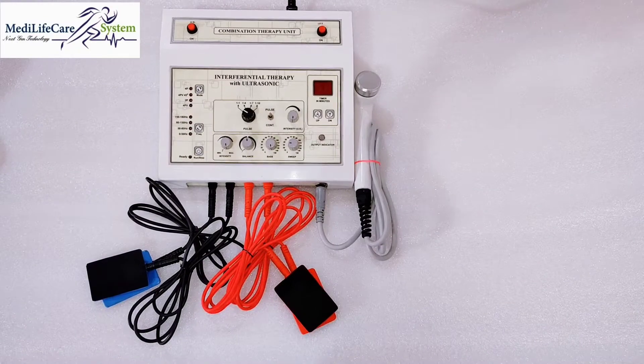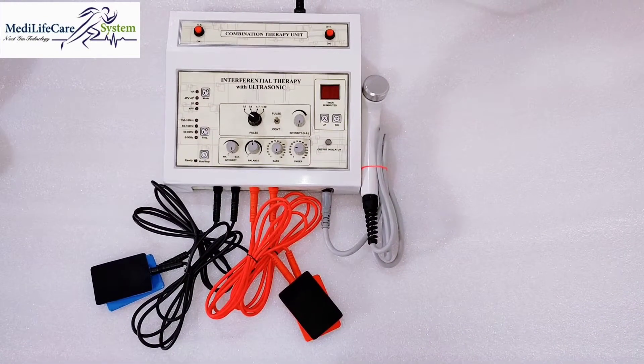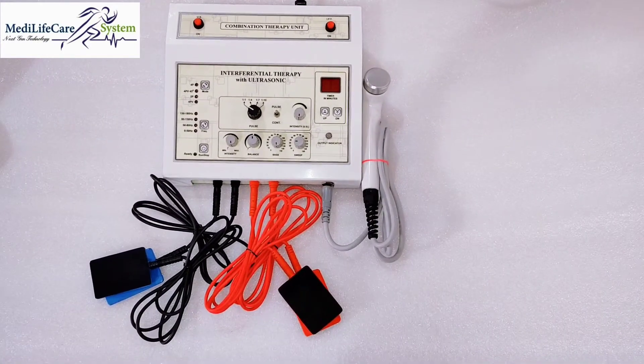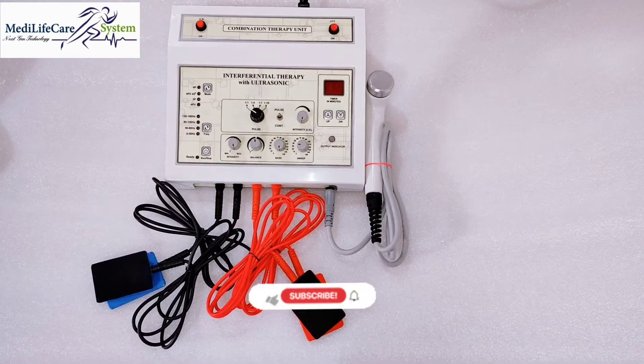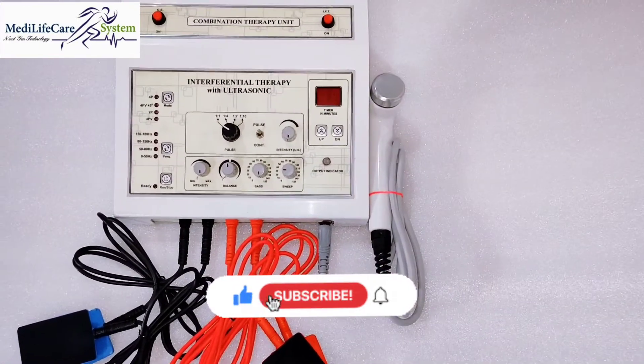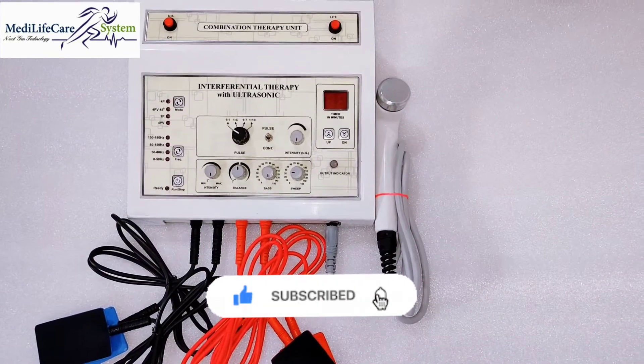Hello everyone, this is Laxman Sunar from Madlife Care System. Today we are going to do a demonstration video for manual IFT with ultrasonic therapy. In this machine you will get IFT and ultrasonic — there is IFT manual and also one megahertz ultrasonic in this machine.